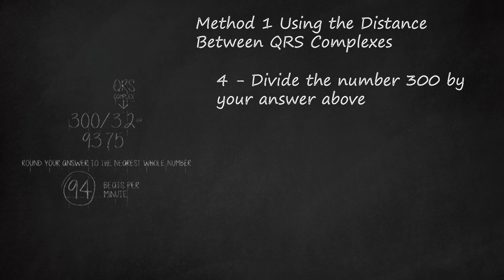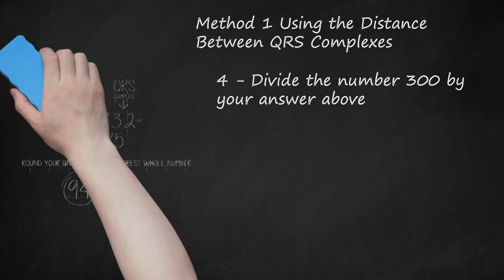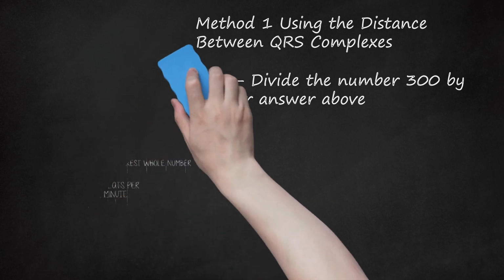Note that a normal heart rate is between 60 to 100 beats per minute. Knowing this can help to guide whether you are on course with your heart rate calculations. However, 60 to 100 beats per minute is only a loose guideline. Many athletes who are in excellent physical shape have lower resting heart rates. There are also disease states that can provoke unhealthy slower heart rates, called pathological bradycardias, and diseases that can lead to an unnaturally accelerated heart rate, called pathological tachycardias. Speak to a physician if the person you are calculating heart rate for appears to have an abnormal value.